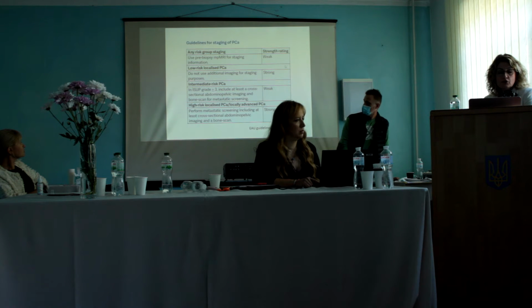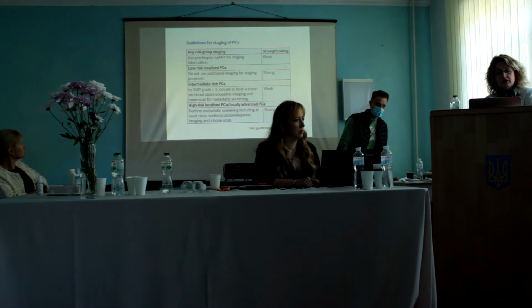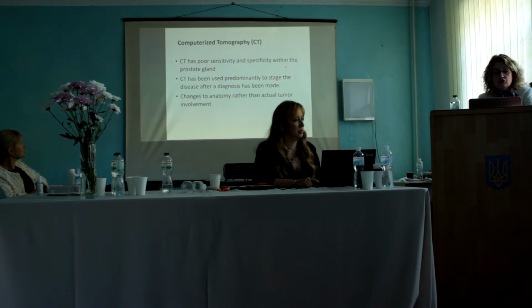CT may show evidence of metastatic spread to pelvic lymph nodes, seminal vesicle invasion, and occasionally demonstrate the sclerotic deposits characteristic of osseous metastasis from prostate adenocarcinoma. CT can give information about changes to anatomy rather than actual tumor involvement.